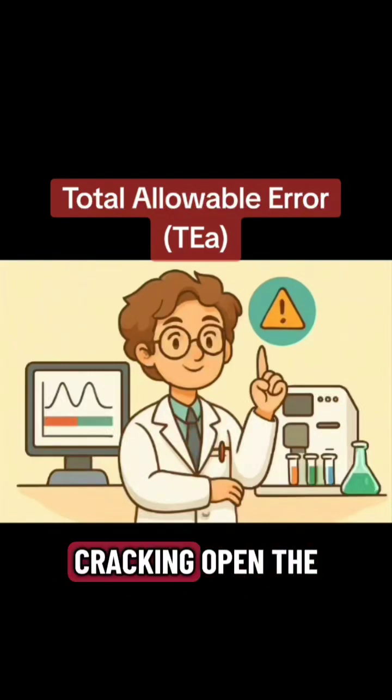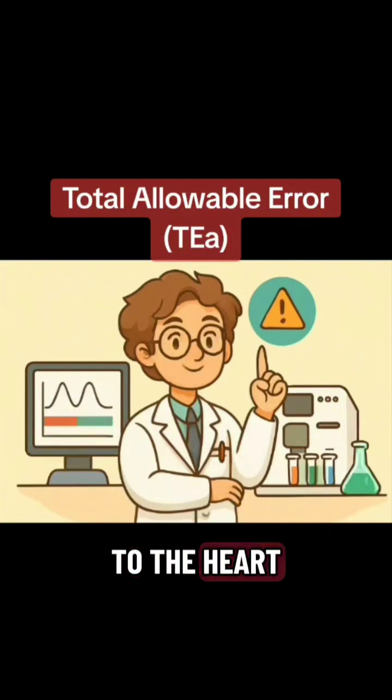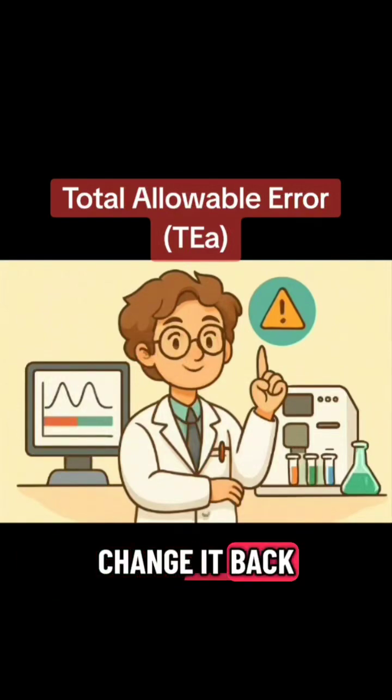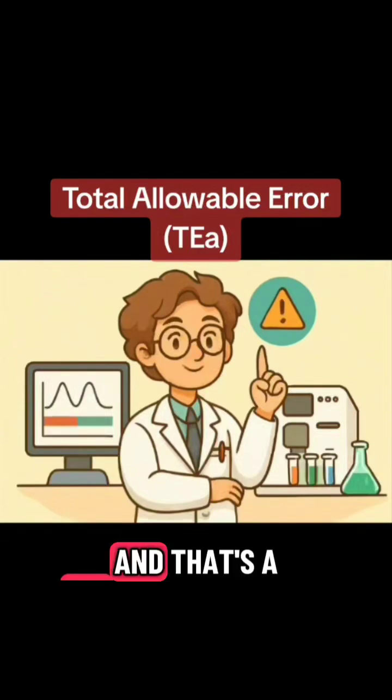Today, we're cracking open the essential playbook for anyone operating in a clinical laboratory. We're going right to the heart of how analysts make real evidence-based decisions when they're adopting new technology. Every time a new analyzer rolls in or you change a batch of reagent, the gut reaction question is always, are the results accurate? And that's a good starting point.